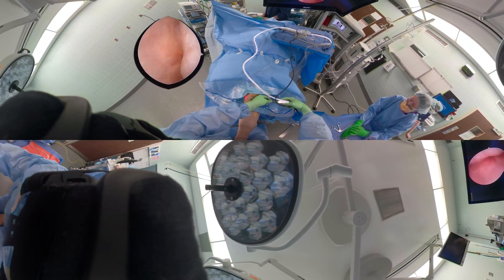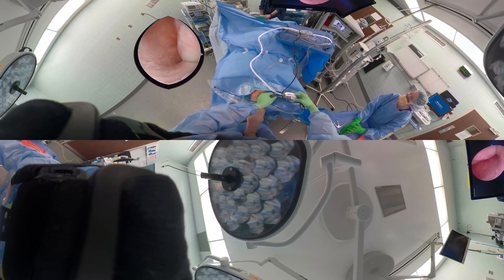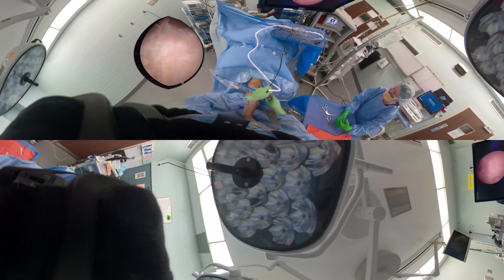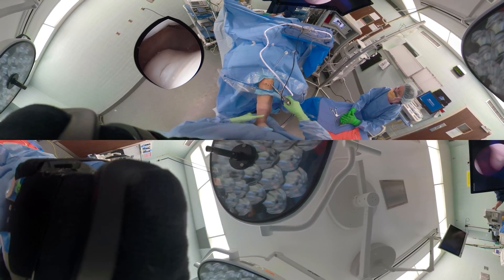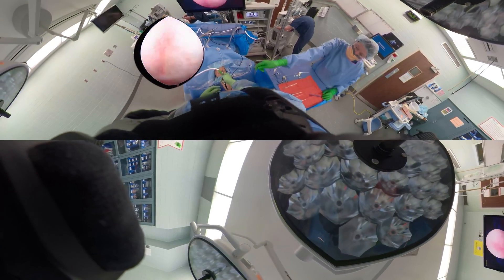The medial meniscus is down at the bottom as you can see in the arthroscopic view. You can flush the knee out — if there's fluid or hemarthrosis, sometimes you have to flush it by leaving the cannula in, removing the scope, and letting gravity help you clear the knee. There's a little bubble there on the trochlear groove.